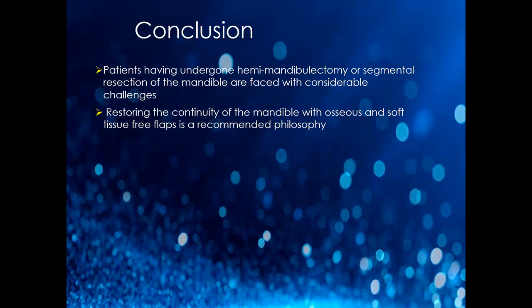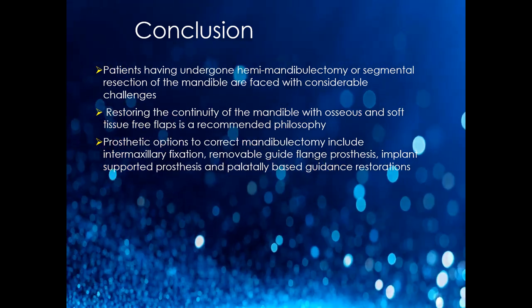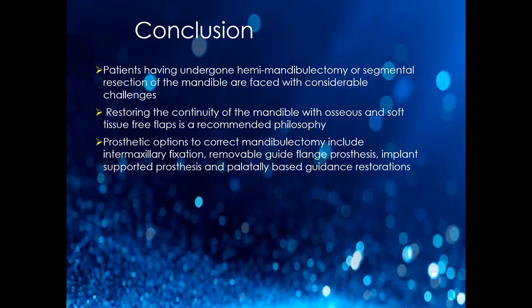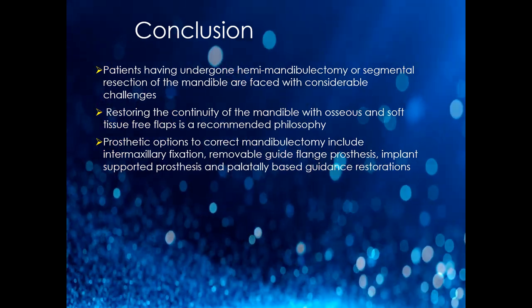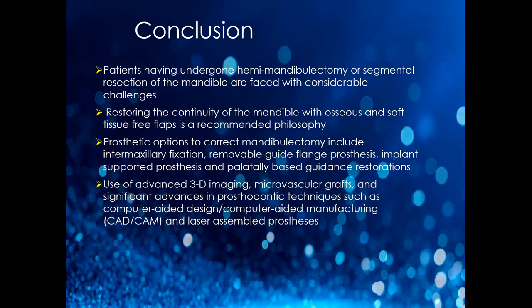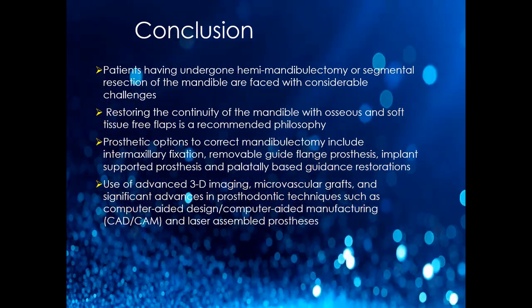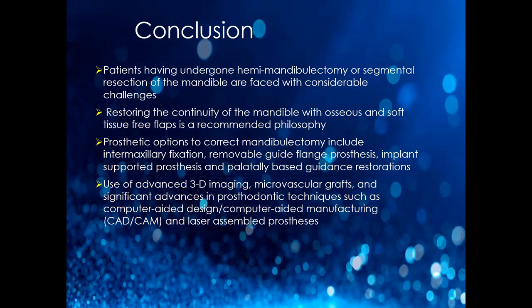And recently we have seen the use of advanced 3D imaging, microvascular grafts, and also significant advances in prosthodontic techniques such as CAD/CAM and also laser assembled prostheses have allowed these patients to be rehabilitated to a near normal function and aesthetics. So the main idea behind the treatment of a hemimandibulectomy patient is that importance should not be given to what is lost in the removal of disease, but rather taking complete advantage of the remaining structures.